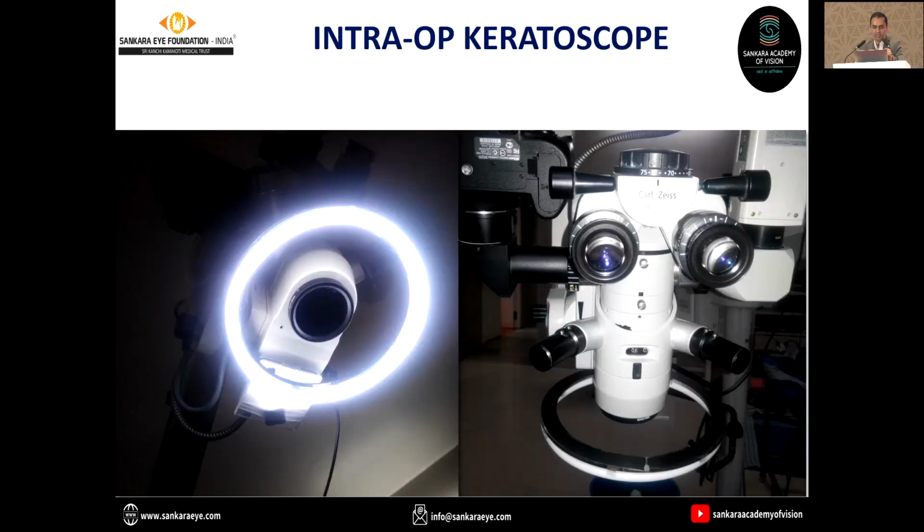We got this flexible LED light for just about $200 from Amazon, and this is how it looks. This was placed underneath the microscope at the level of the objective. The distance of this ring to the eye, to the cornea, was what we calculated. That is how we were able to deduce the diameter of this ring.